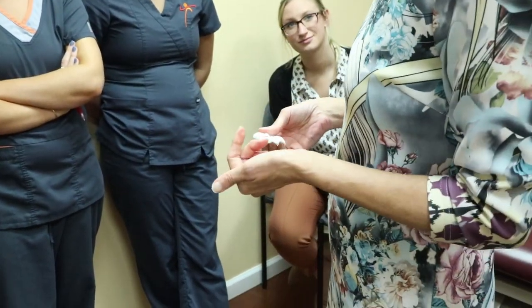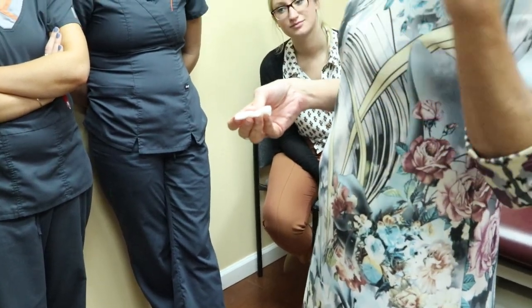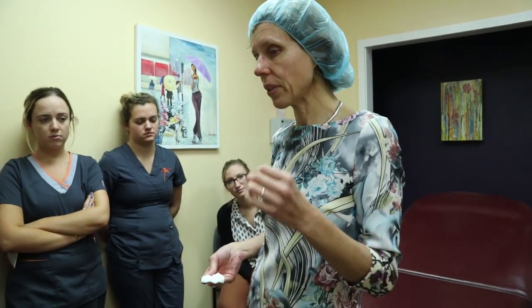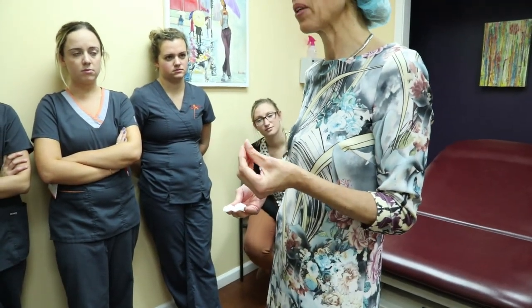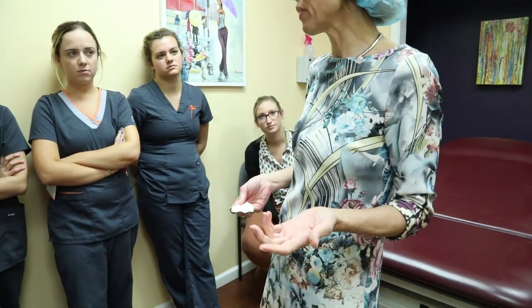This is the moment where you must have gloves on. But if you leave your gloves on too long, they become very sticky and tacky — it becomes very awkward. So it needs to be a very quick process.